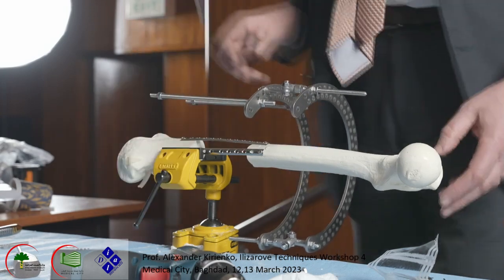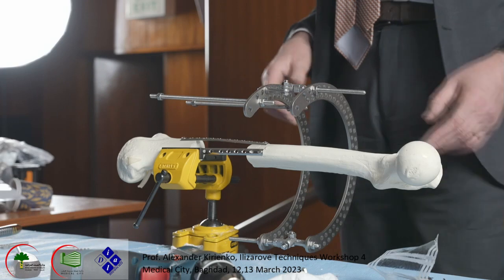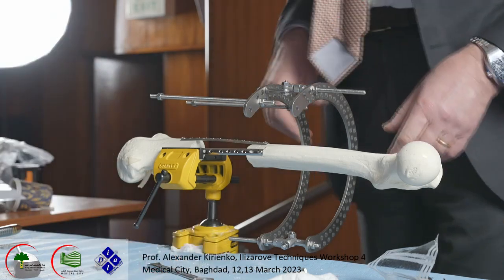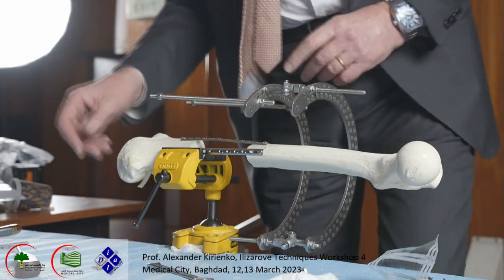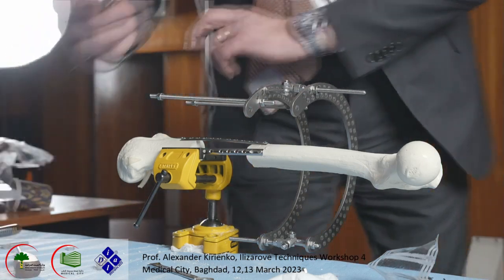okay, now we put again the other half pin. Okay, this.